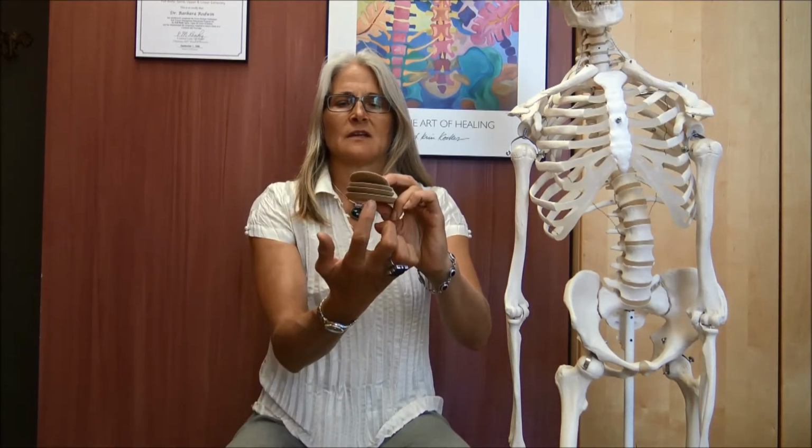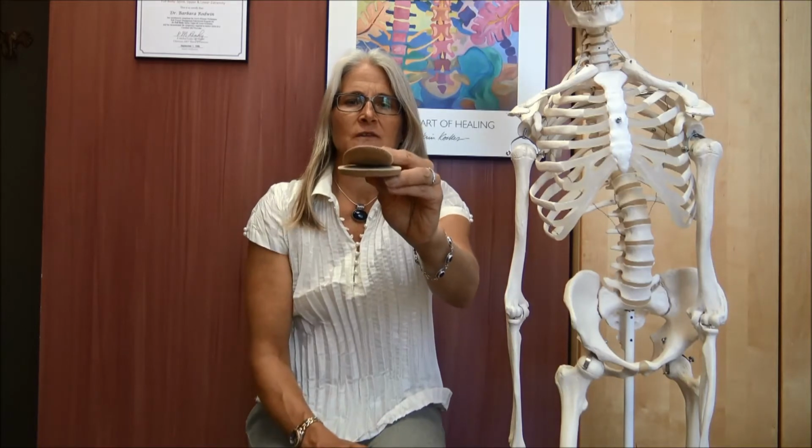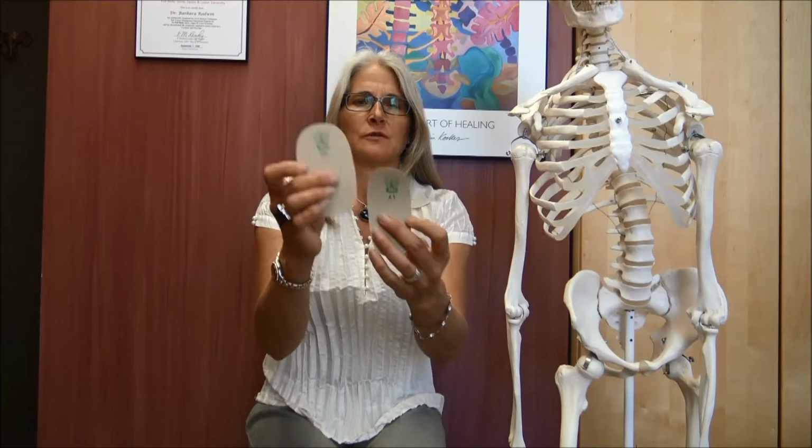So with respect to the heel lifts, there's actually 4 different heights. I have them in my hand, and you can probably see that as you go down, they get thicker. On the lifts, there's actually a letter and a number. The letter corresponds to the height of the lift. The number corresponds to the width. Because the A1 compared to a D4, you can see that it's actually thicker, but it's also wider, the D4. So each lift has 4 different widths. So the A, which is 1/8 of an inch, has an A1, 2, 3, 4.